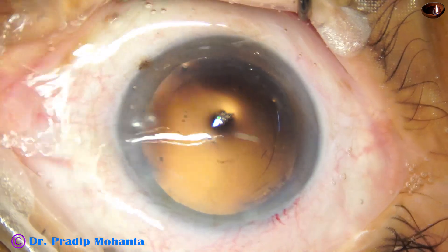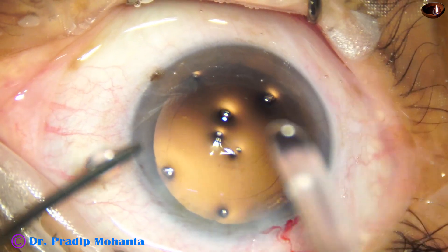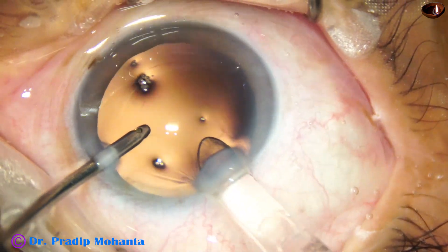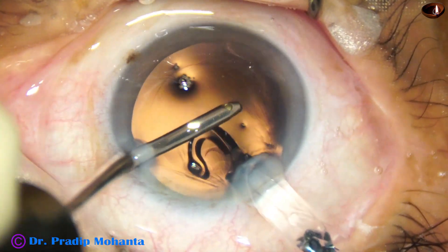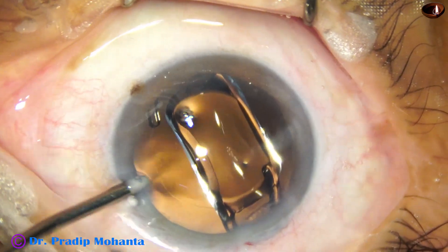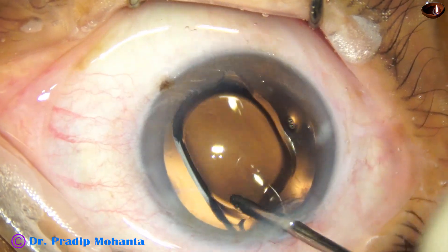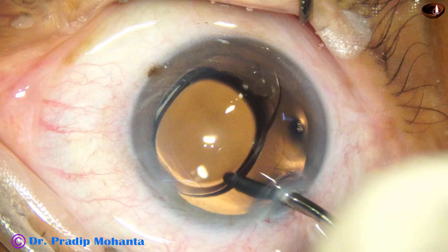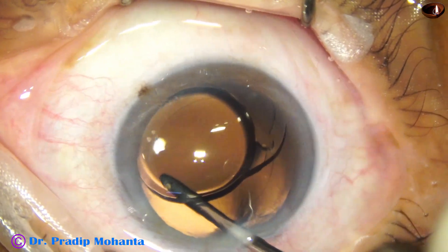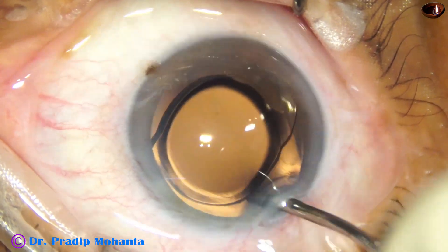The main wound is enlarged a bit because I am using a B cartridge, and now here goes the intraocular lens — this is a beautiful lens from Johnson & Johnson Sensar. The leading haptic goes into the capsular bag, and the trailing haptic is placed in the bag by the irrigating probe itself. The irrigating probe dials the lens and places the haptics about 90 degrees away from the main wound, and the case is almost done.